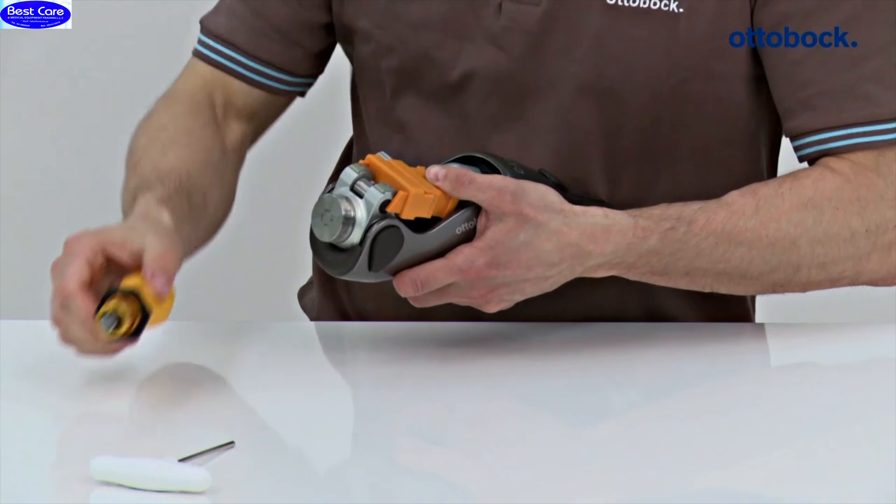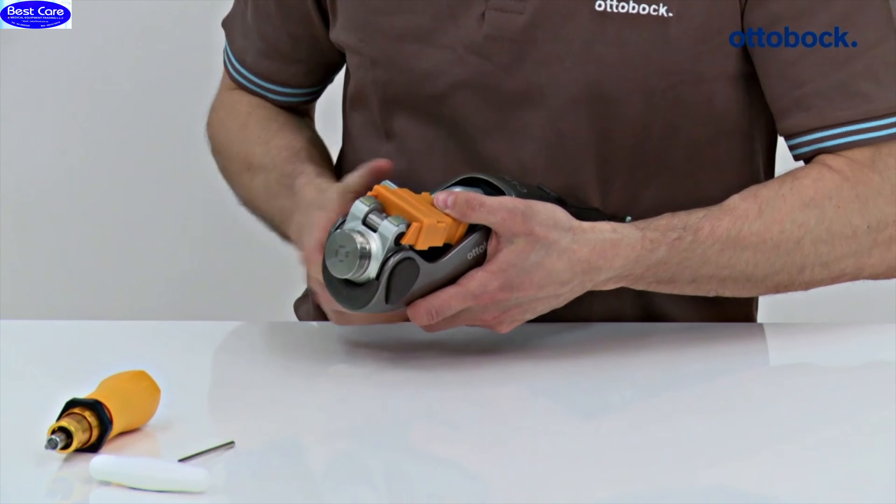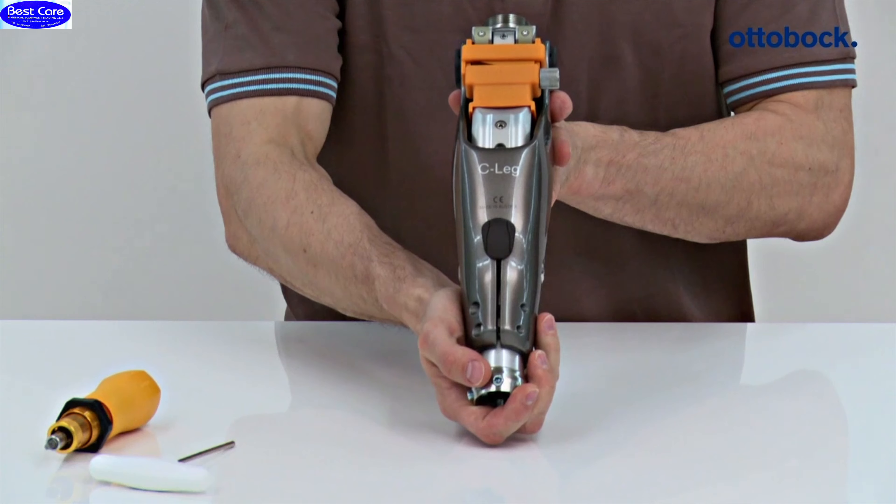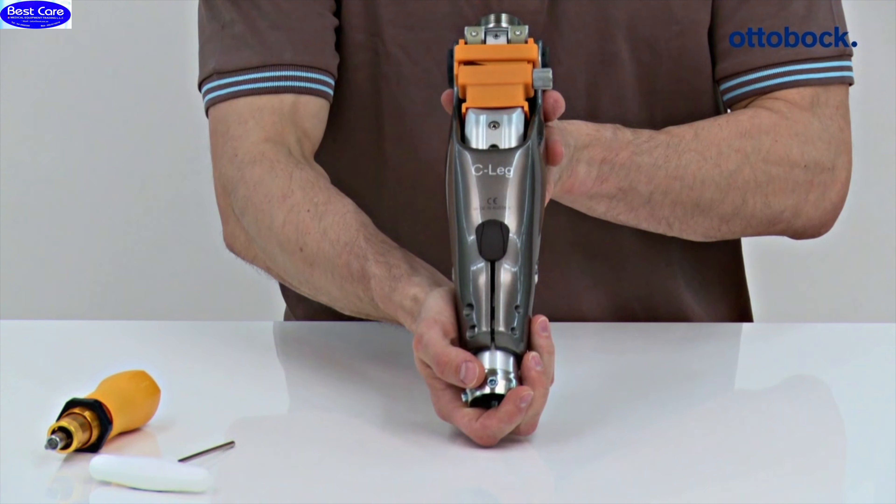If you don't have a torque wrench with a suitable range, then turn the adjustment screw 10 turns further using a size 4 Allen key. The knee joint is now in the correct position for bench alignment.